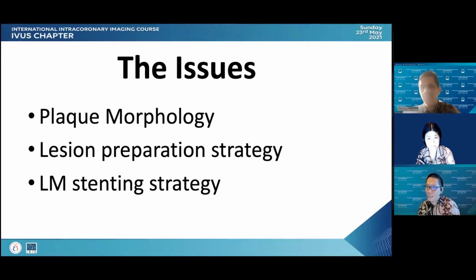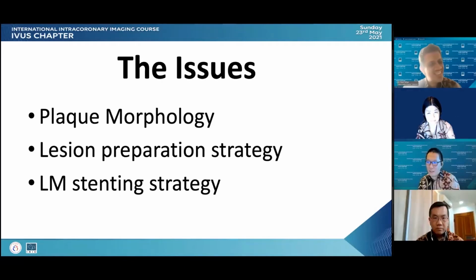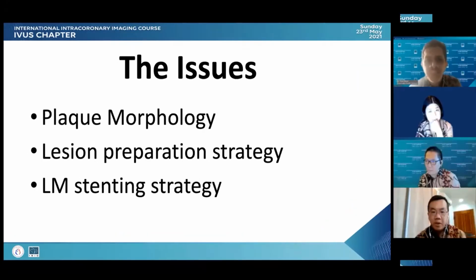Yeah, I think it's definitely a 1,1,1 lesion with a calcium spot, and rotational atherectomy, I think, is a little bit dangerous for this case. But maybe I would try some scoring balloon first, from the Left-Main to circumflex and Left-Main to the LAD, and then see with IVUS what happened after the scoring or cutting balloon procedure. And then for stenting, I would choose Culotte stenting for this Left-Main bifurcation lesion. That's my opinion. Okay, thank you very much.